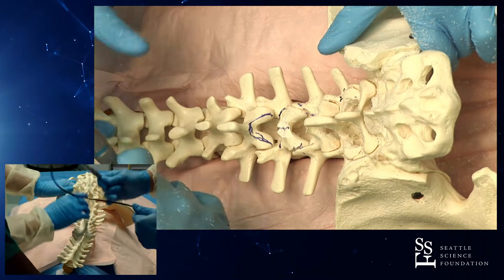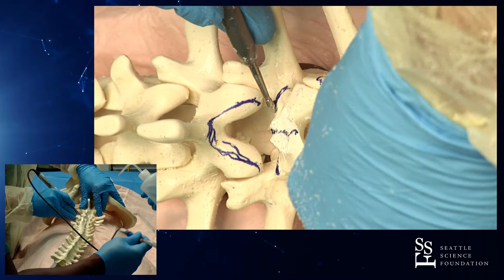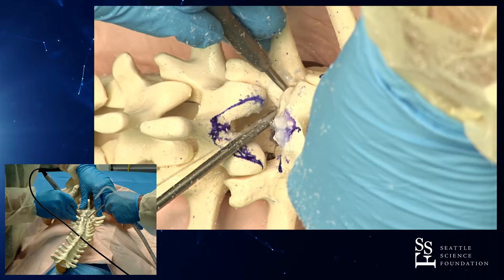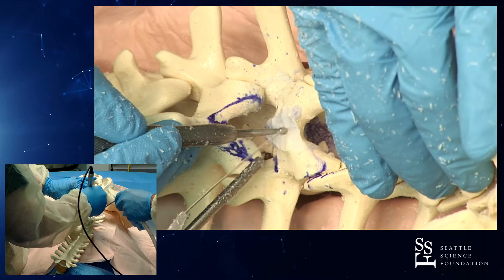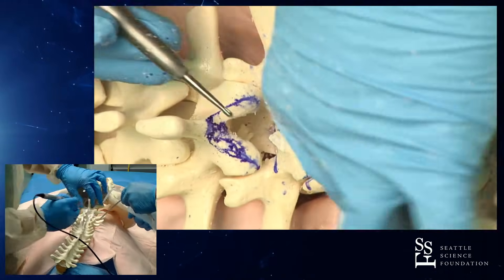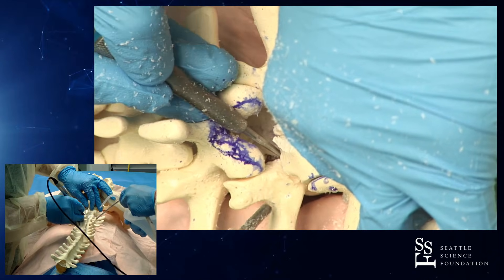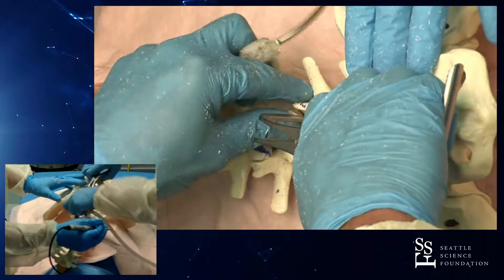The nice thing about these letters is it's highly reproducible and easily identifiable. Irrigation coming. Vertical — what are you going to do first? Pars cut? You're going to watch the root below so there's no plunging. Now vertical cut. And this cut here. And now, we're going to put a spreader in and pop the lamina open. This is a very atraumatic move.